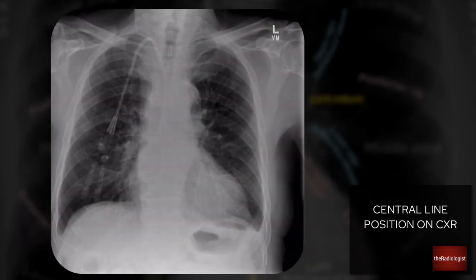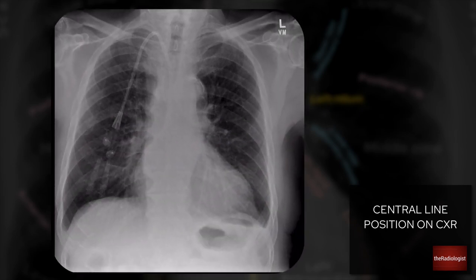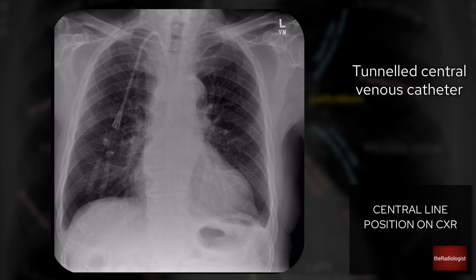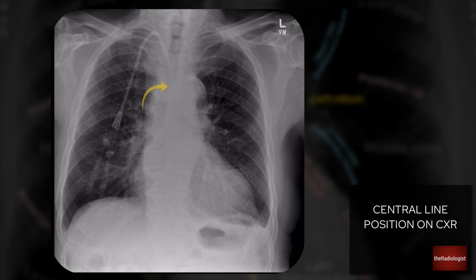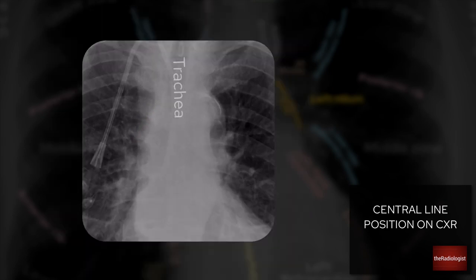Case 2: Again check for rotation — spinous processes look in the middle of the medial clavicles, so that's fine. This is a different kind of line: we can see the end hanging out of the chest with two lumens — this is a tunneled catheter used for dialysis. Following it through, it should take a vertical course on the right side of the mediastinum in the region of the SVC. I can see what looks like the SVC over here; however, the line doesn't go there. It's going more medially, taking the position of where the trachea is and heading in that direction. I need to be worried that this line is not in the correct position.